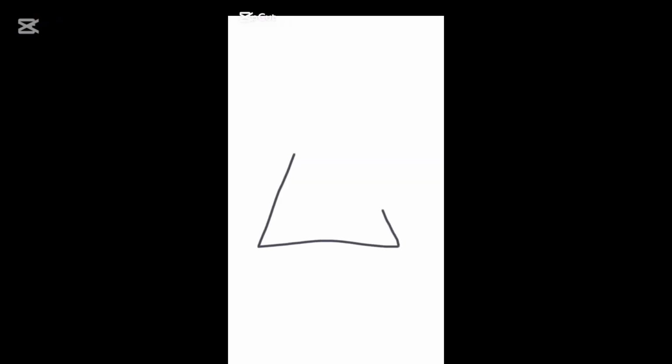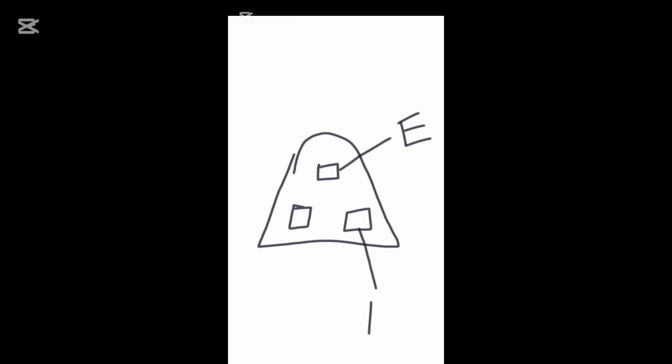Next thing I'll be talking about are the symbols of these components. Yes, you have known the components of heating equipment, but me and you know that you also love to see the symbols. This that I'm drawing right now is called plug. Yes, I'm drawing the symbol of a plug that has three pins. The upper pin is called earth and is grounded. The left pin is called neutral, whereas the other pin is called line.